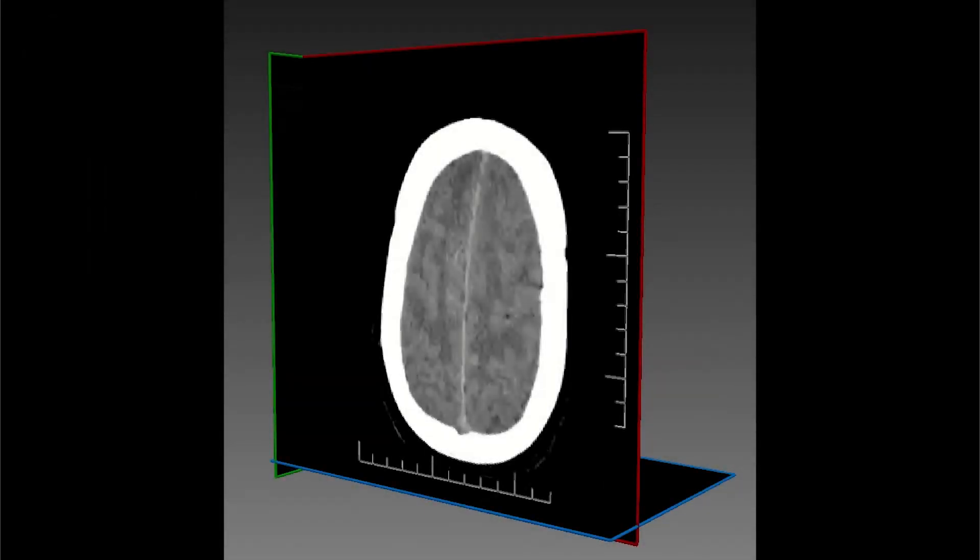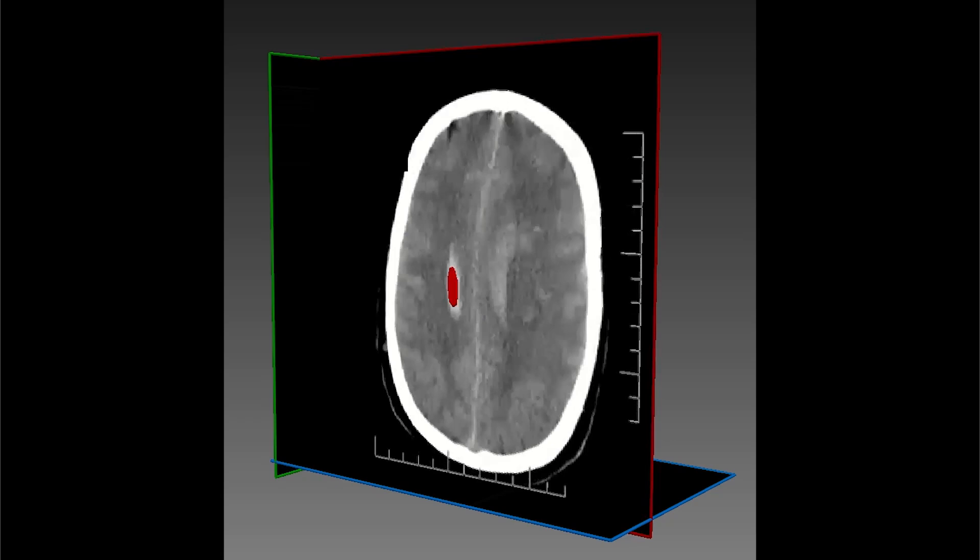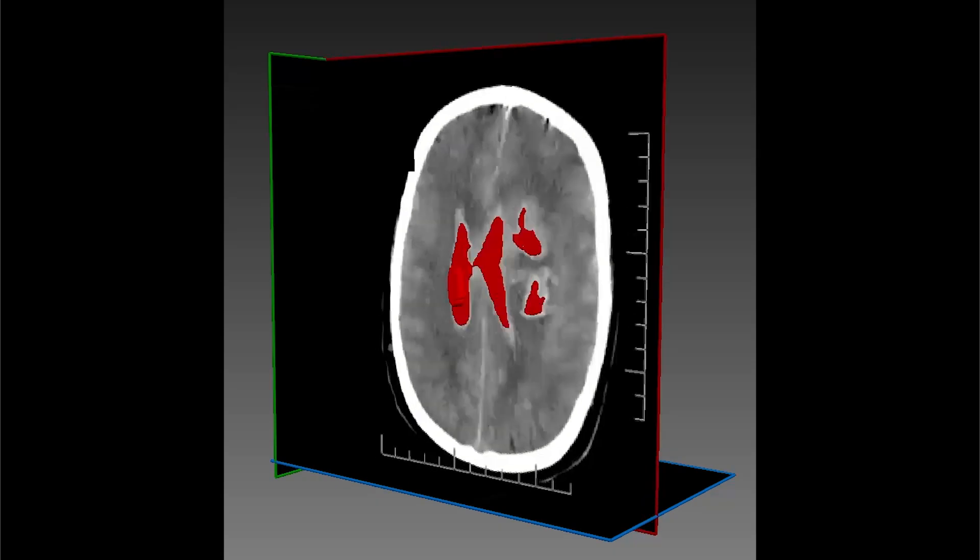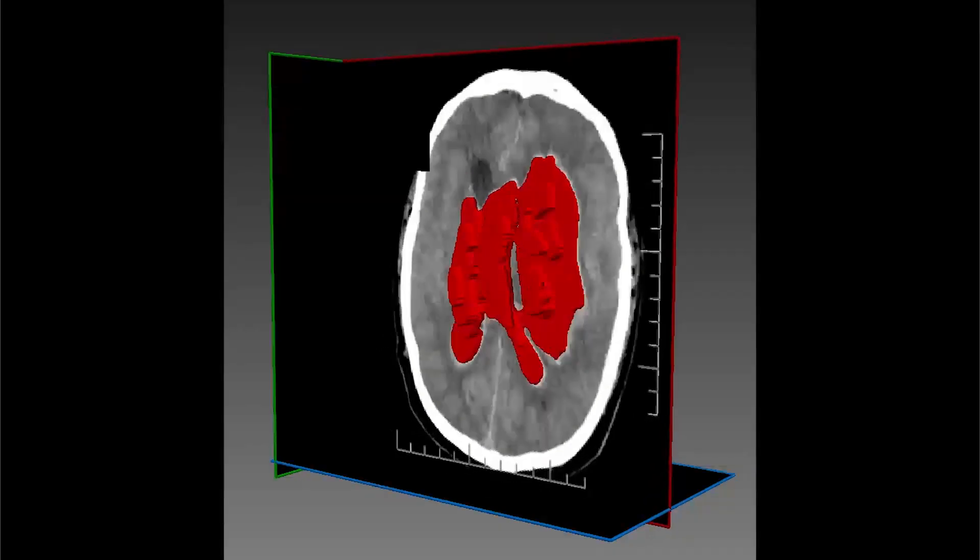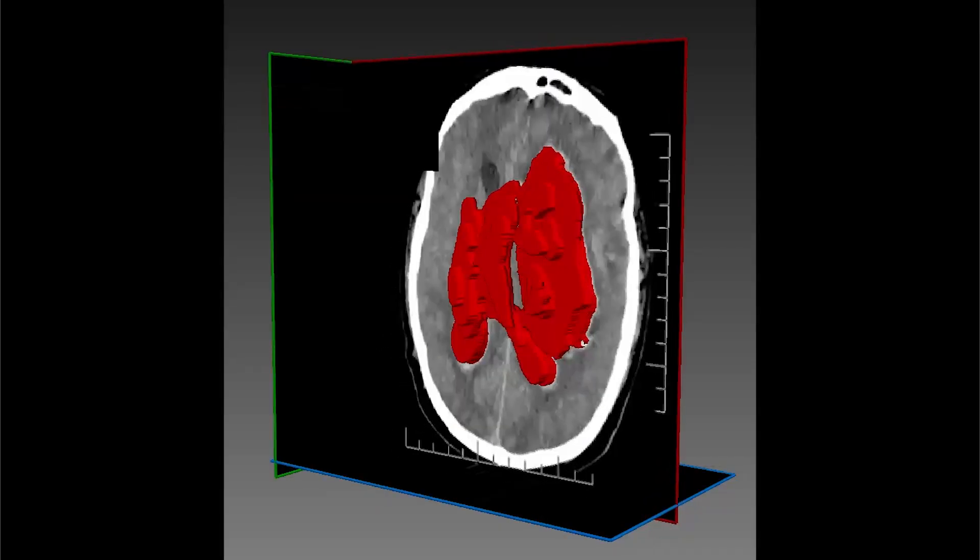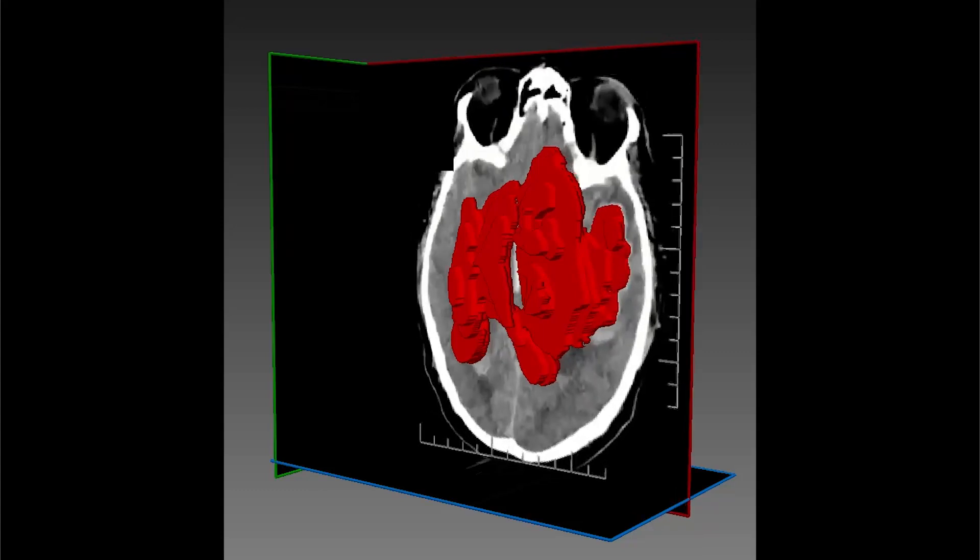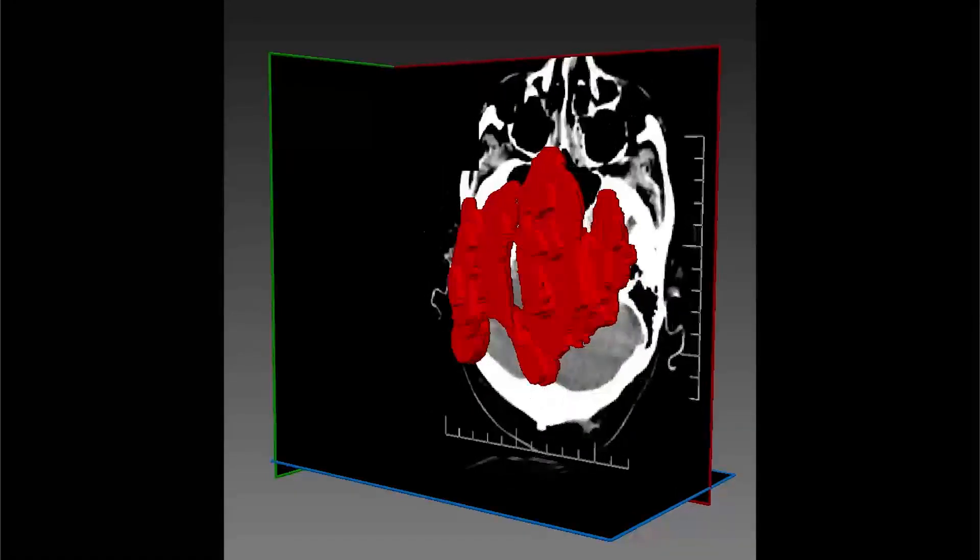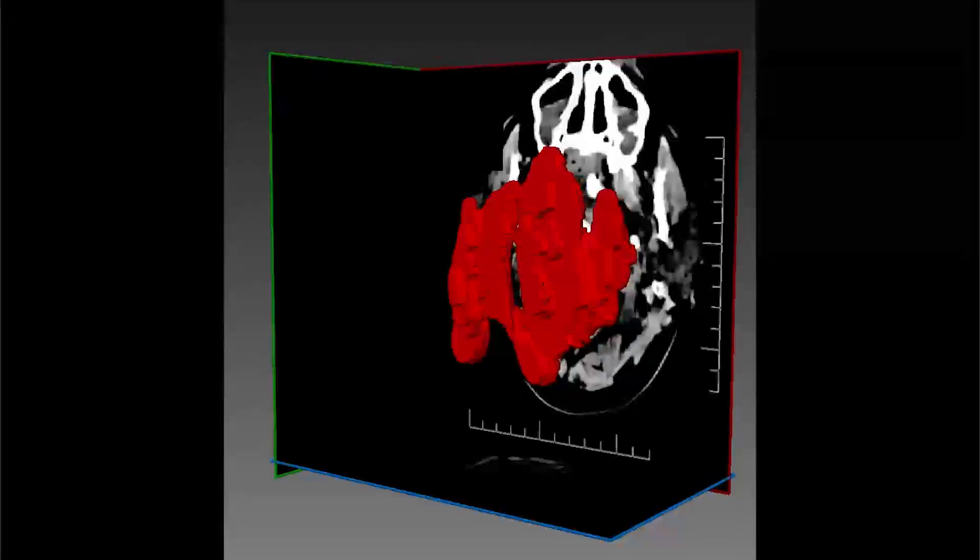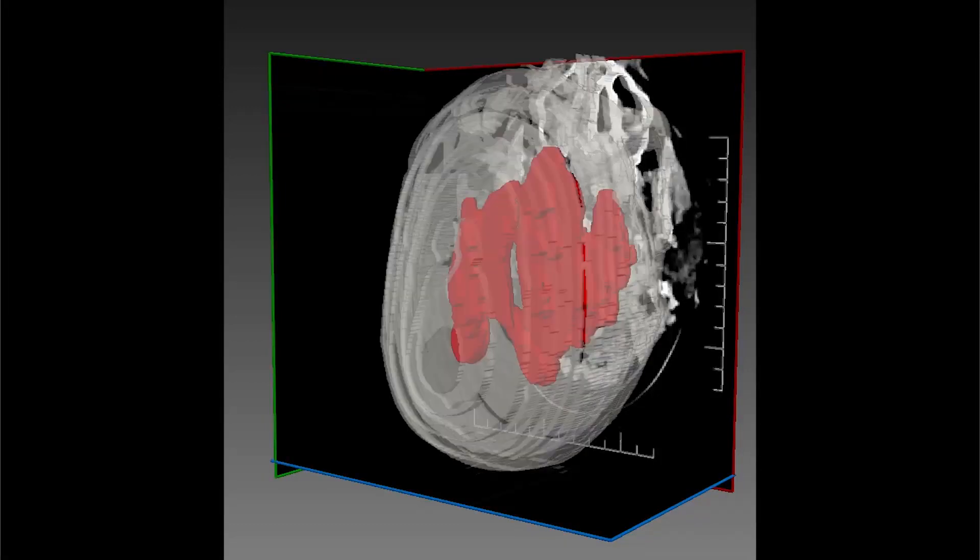An intracranial hemorrhage is a condition in which a blood vessel erupts inside the brain, causing internal bleeding. If not treated correctly and immediately, a brain hemorrhage can be deadly. This type of hemorrhage is usually diagnosed using a CT or MRI scan.